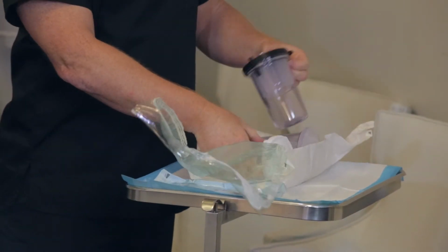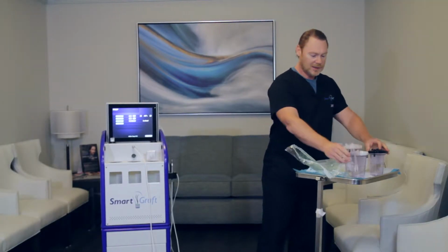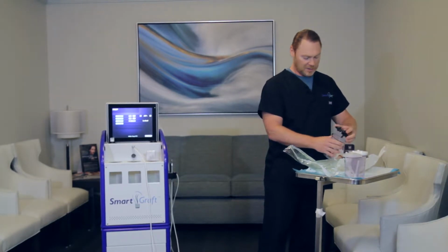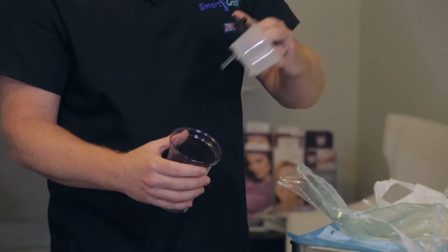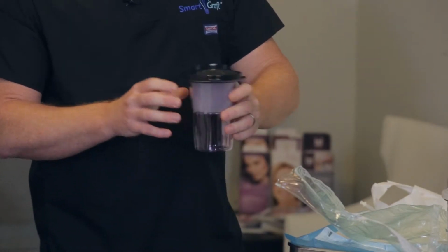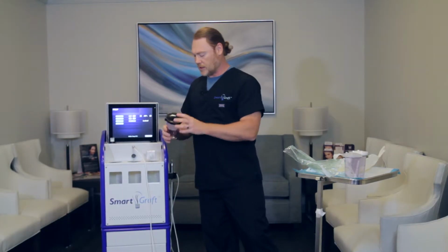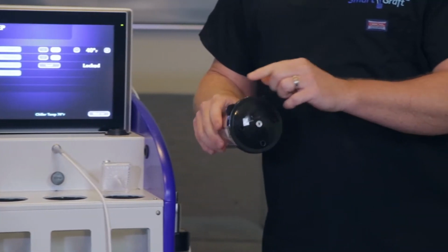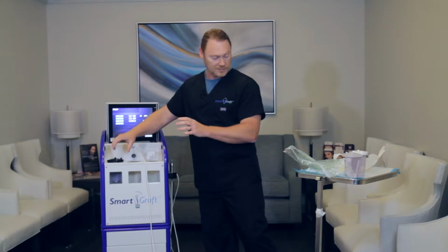Okay, you'll notice that there are 3 different canisters in here, all with different color lids. That really helps you to distinguish which ones go in what places. The first one that we put in is actually the graft canister. This has a basket for the grafts to go into, and that'll go into the first position over into the left-hand side. Now, the way that I like to set this up that makes it easier for the tubes to be aligned properly is to use these opening top tabs all facing towards the left-hand side.